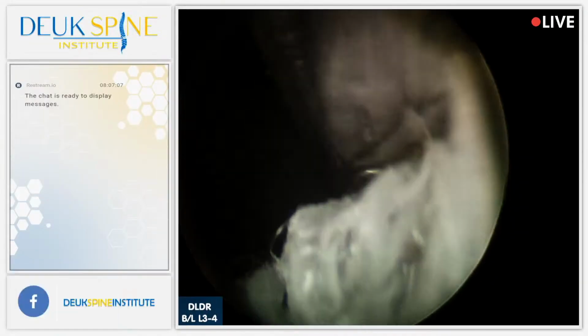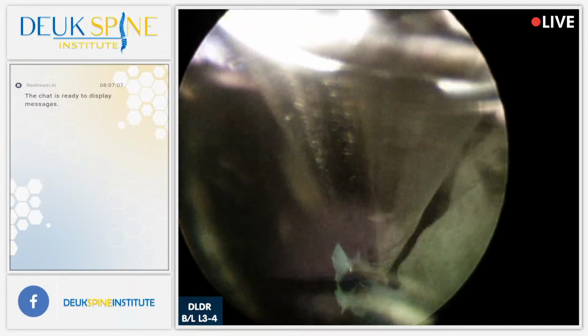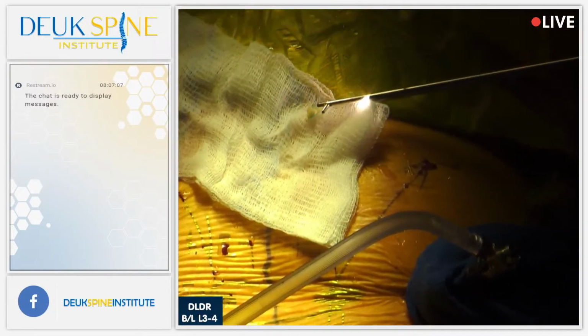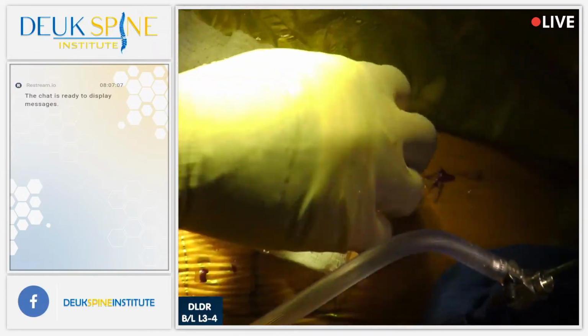Hey, can we switch the lights, please? All right, you guys see the herniation we just took out? It's a nice little piece right here. Yes, we do. All right, thank you.